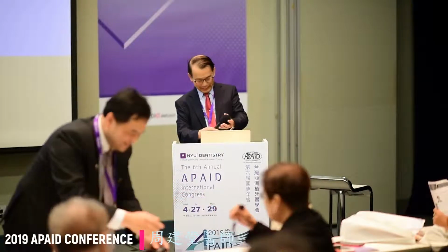Doctor, just for clarification, on the day of the surgery, you were able to restore a provisional restoration? The same day, if we could, we do that, because mostly we have no time on the chair side, and the other reason is that there is bleeding and maybe the anesthesia disappears. So I prefer to do it at the time of the surgery, immediately.